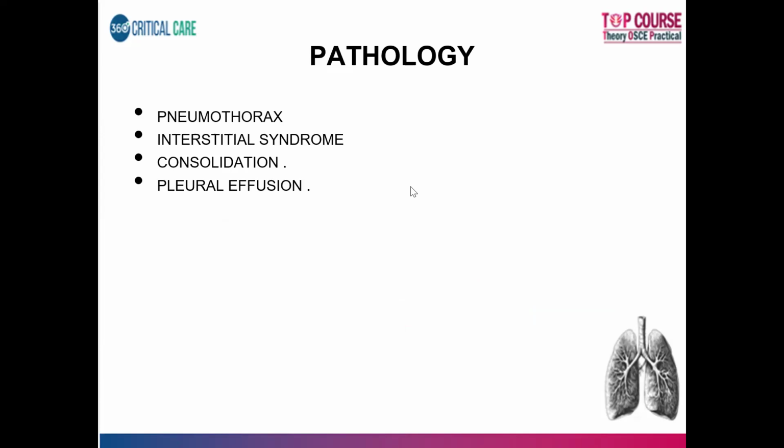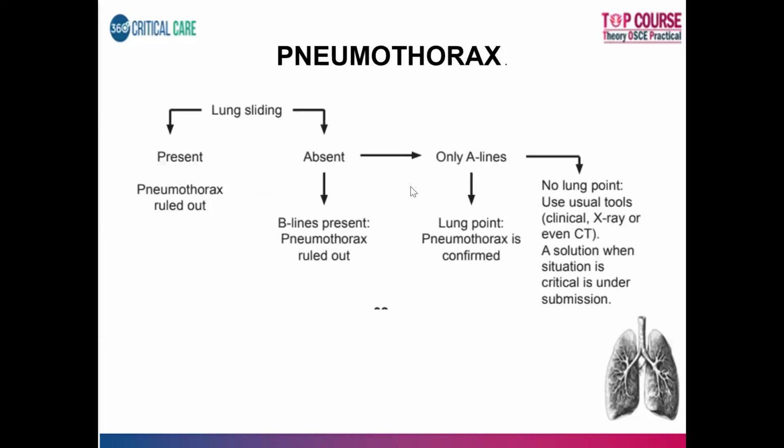So now we will go on to the pathologies. Okay, so we were talking a lot about pneumothorax. So we'll start with that. We'll go on to interstitial syndrome, consolidation, and pleural effusion.